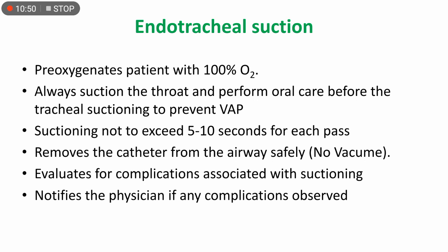Evaluate for complications associated with suctioning, such as desaturation, tachycardia, or bradycardia. Notify the physician if any complications are observed.